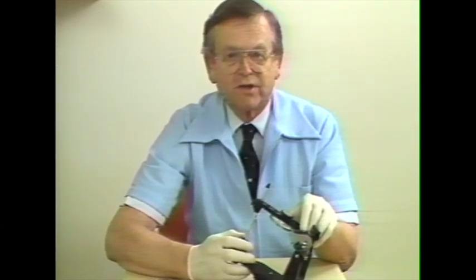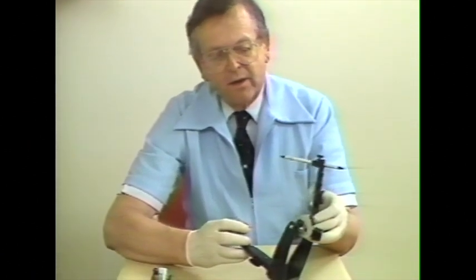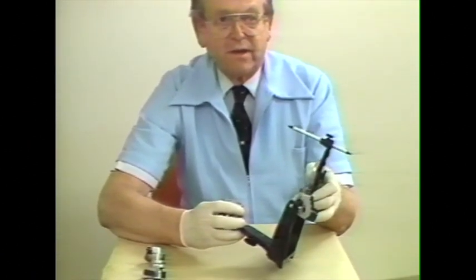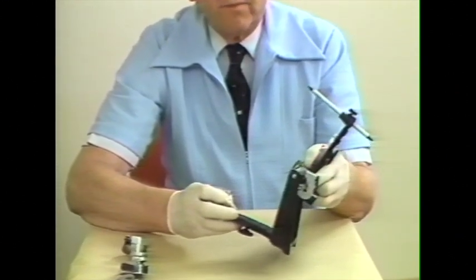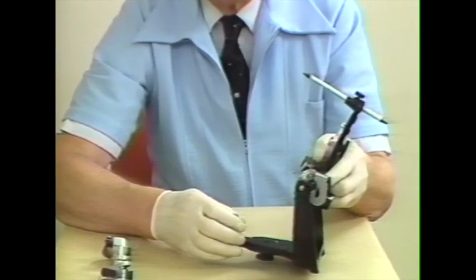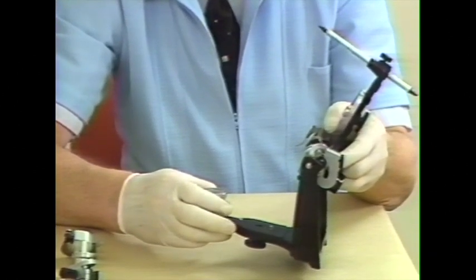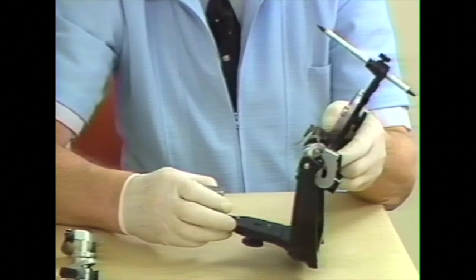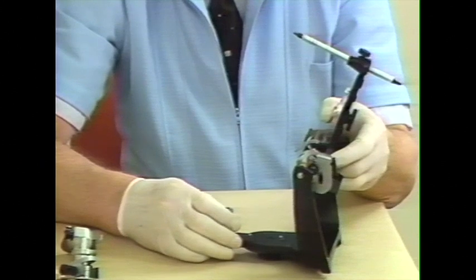The Modular articulator has a number of features which allow the clinician to select the type of articulator he desires. First, it is an Arcon articulator, which means that the condylar elements are on the mandibular arch and the fossae elements are on the maxillary. This more closely duplicates the actual relationship on the patient.